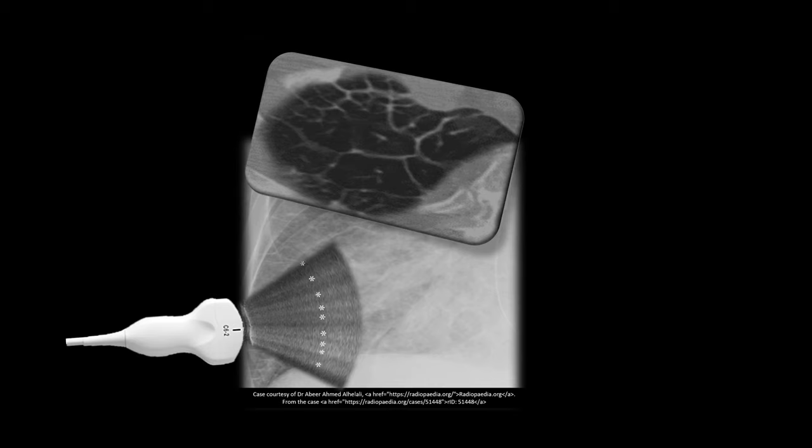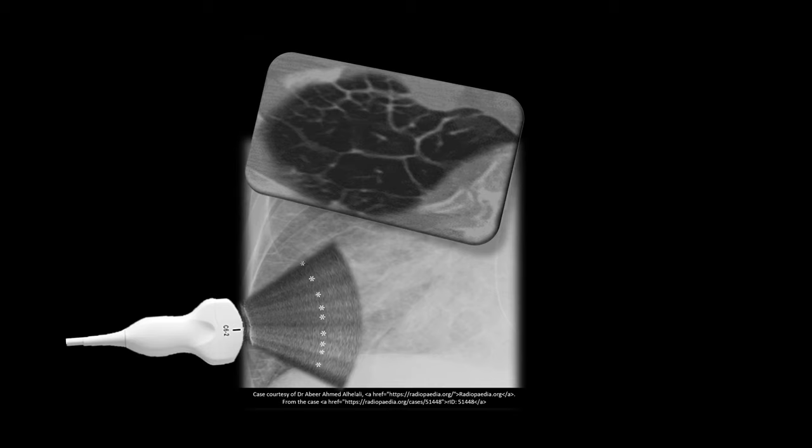To sum up, the main finding in the first phase of the cardiogenic pulmonary edema, called interstitial edema, will be the interlobular septal thickening.